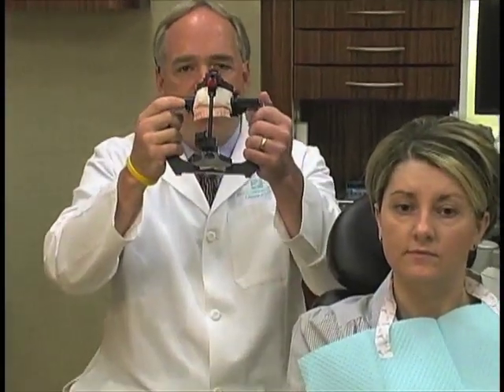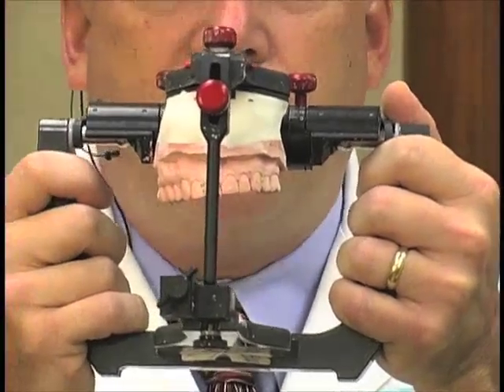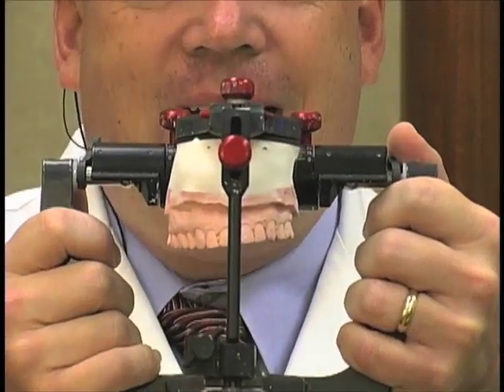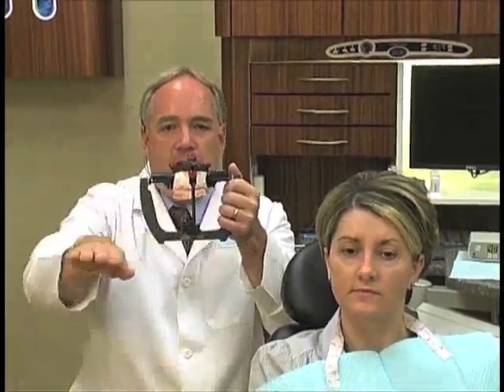This patient's maxillary occlusal plane has an absolute tremendous cant to it. In the photographic section, I'll show you a photograph we take to verify that a cant like this actually exists in the patient — we call it our face bow verification photograph. The point here is this patient is having work done to correct it. Since this maxillary cast is mounted properly, when I correct this plane and put the provisionals in the patient's head, he's going to be level. And that, to me, is one of the most important things.